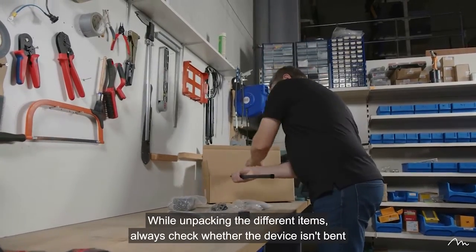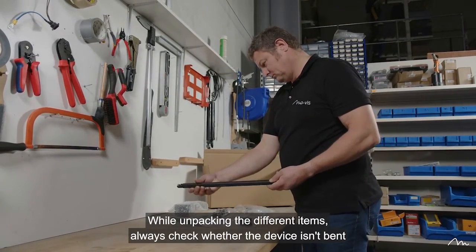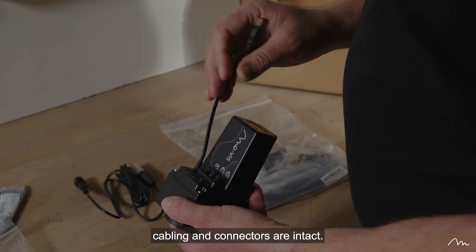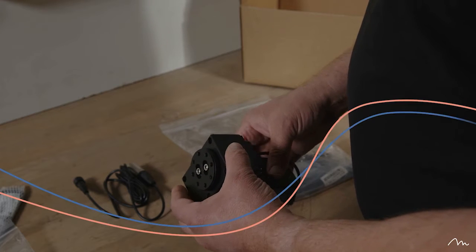While unpacking the different items, always check whether the device isn't bent or damaged. Also verify if the housing, cabling, and connectors are intact.